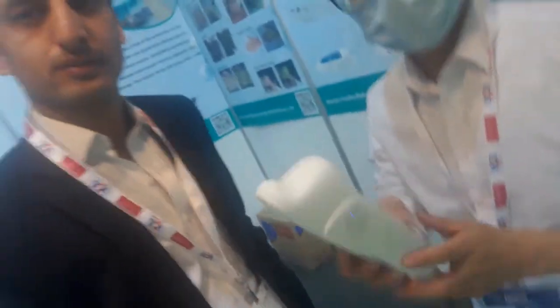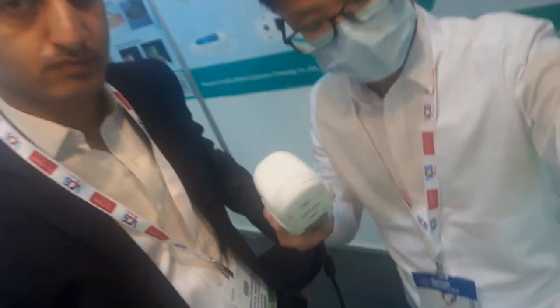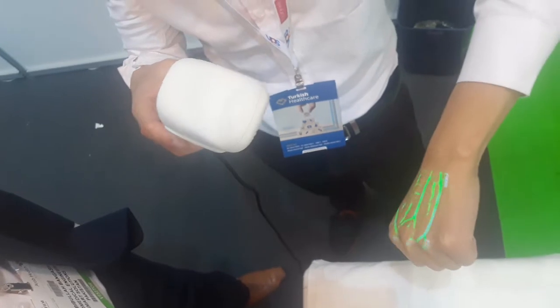Today we are right here at Arab Hela Exhibition 2020 Dubai. I'm at the booth of Shenzhen Yonhom Medical Equipment China. The export manager will be demonstrating their vein viewer. Its model is Vashon 5, their flagship product, which has been exported to various countries across the globe.